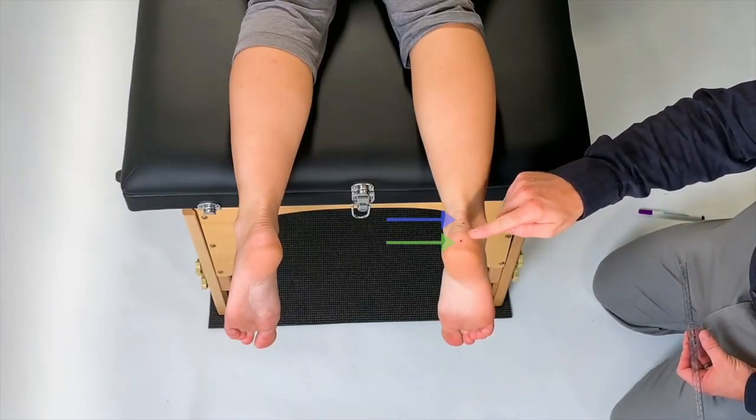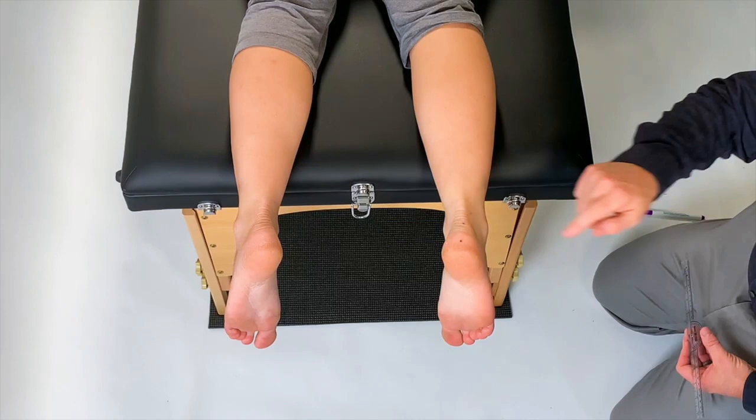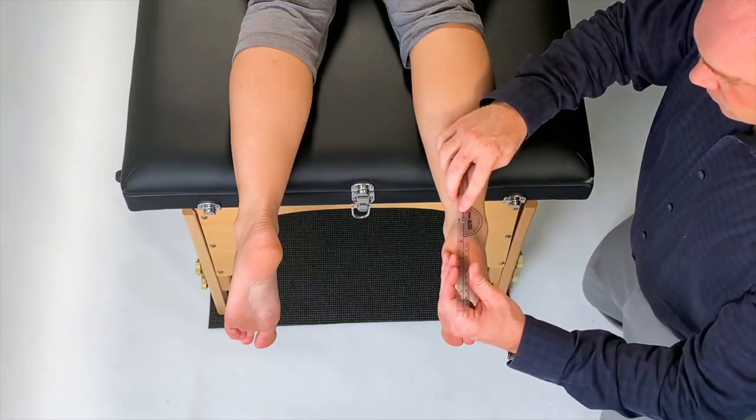With a dry erase marker, mark two dots on the back of your patient's ankle. The more proximal one should be marked at the superior portion of the posterior calcaneus, and the distal dot is to create a midline for the movable arm of the goni.